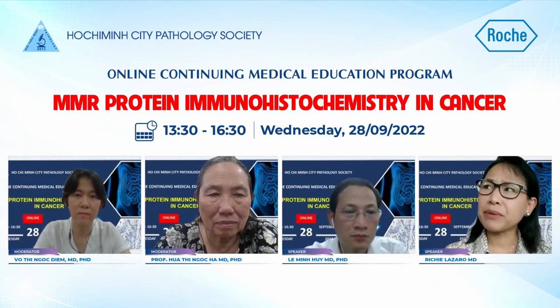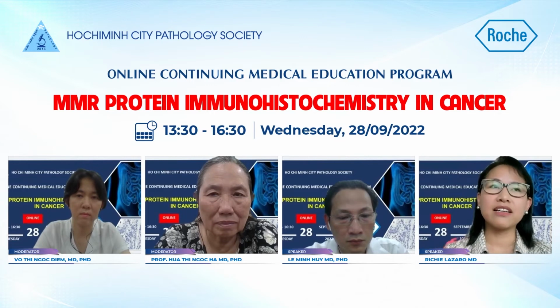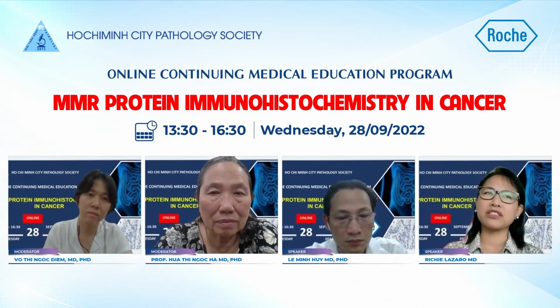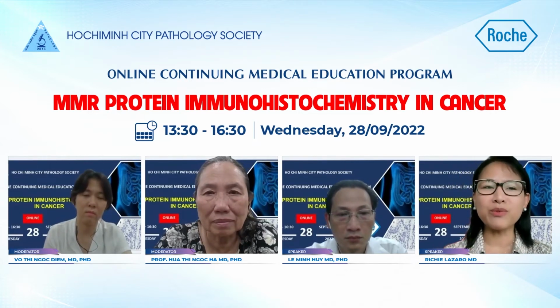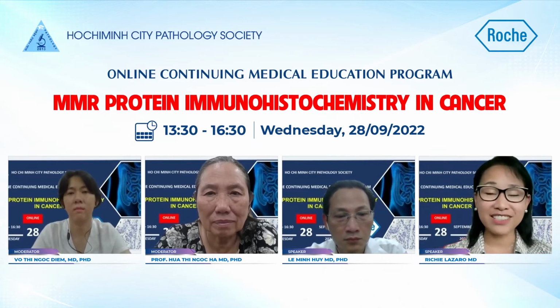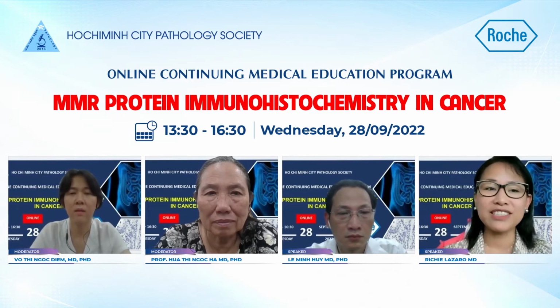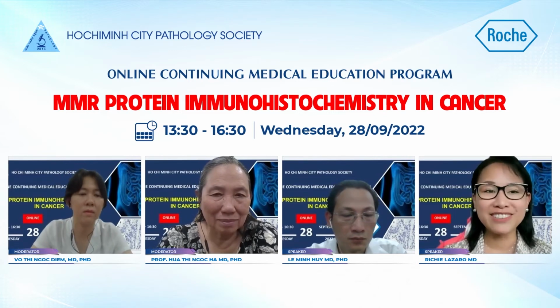And then maybe to compare also if MSI might require less tissue, like the MSI process, sequencing, that's an alternative that could be considered. However, to my understanding, sequencing also would require a substantial amount of cut sections. So at the end of the day, when it comes to limited tissue, I will discuss it with the oncologist to help me prioritize what antibodies and what immunohistochemistry or molecular testing I should do. That's what I will do.